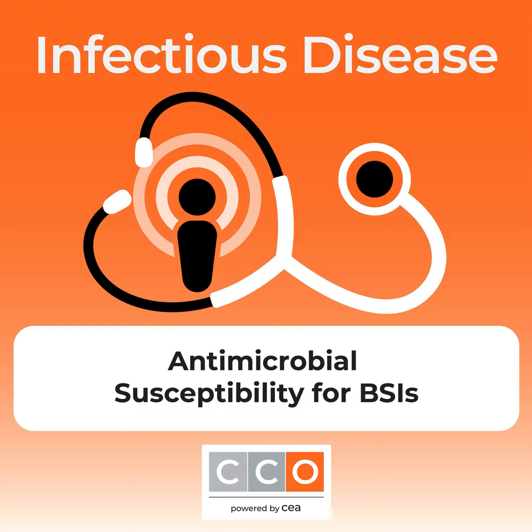The narrow spectrum is ceftriaxone, it's third generation. Lower than that, we don't have any evidence that we can continue de-escalating. So now we have the opportunity to go all the way down to penicillin with inhibitors or even an agent to provide a PO conversion. The other advantage is, in 2024, we have around 1,652 organisms that met this criteria that we will be able to provide rapid AST and have a full susceptibility profile within 10 hours.